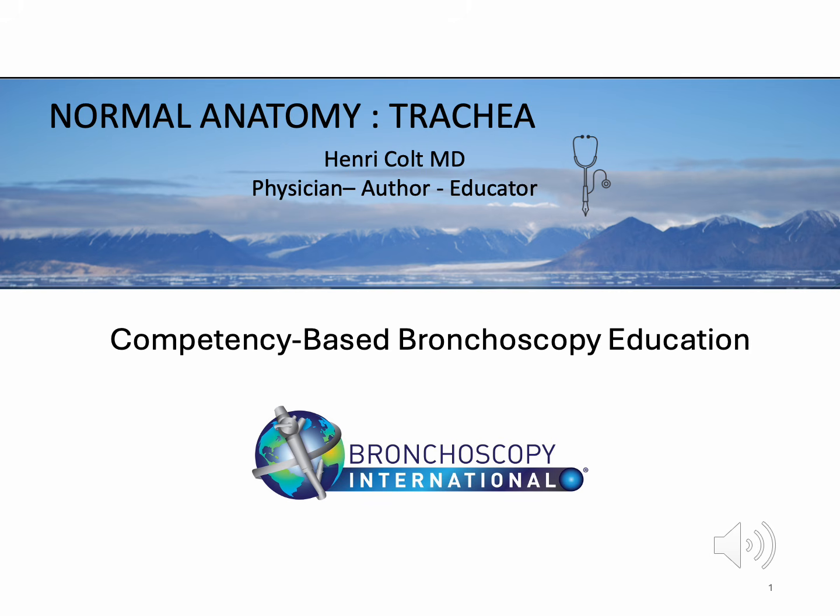The trachea is often described simply as a conduit between the larynx and the bronchi, but during bronchoscopy, the trachea becomes far more than a tube. It is a dynamic anatomical structure whose shape, caliber, flexibility, motion, and relationships provide essential diagnostic information.